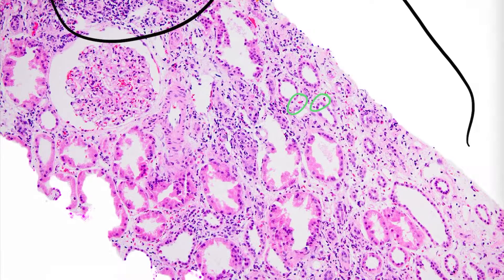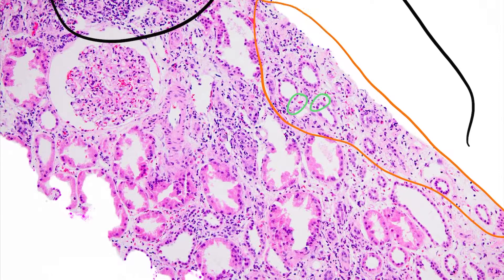We know we are in a good portion of unscarred cortex, at least in this area here, as we can see a component of interstitial edema, which means that while there is injury and edema, there has not been a lot of fibrosis laid down at this time.